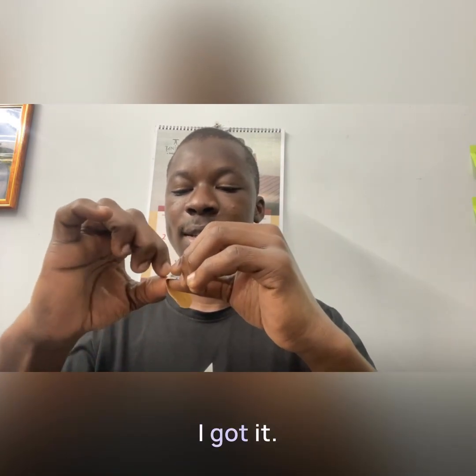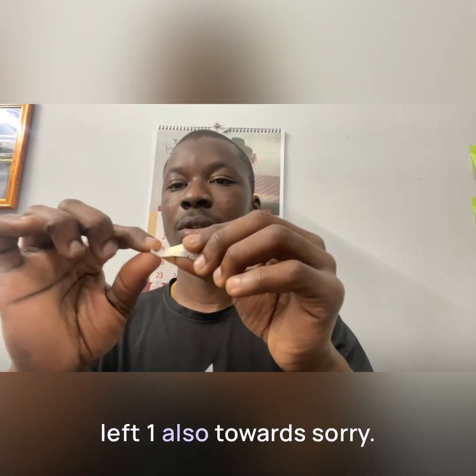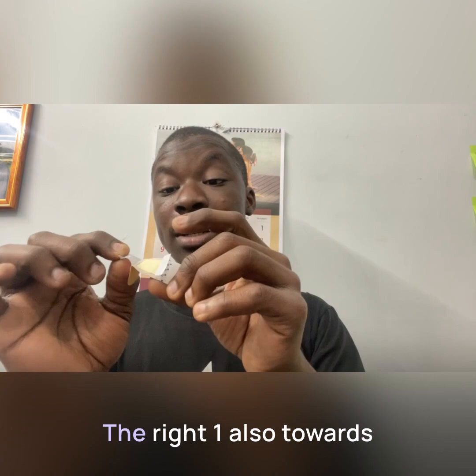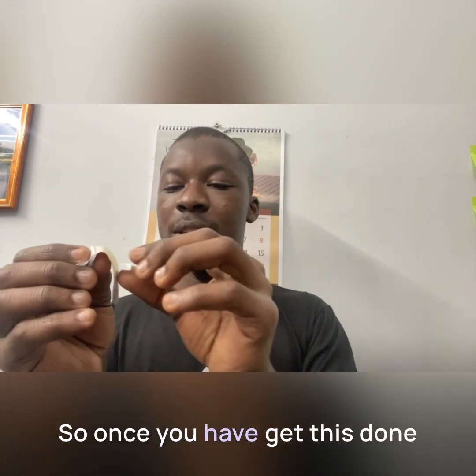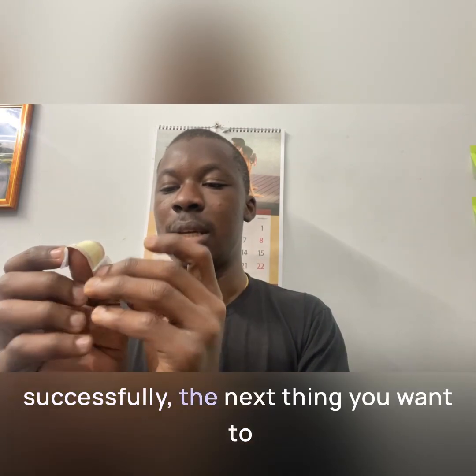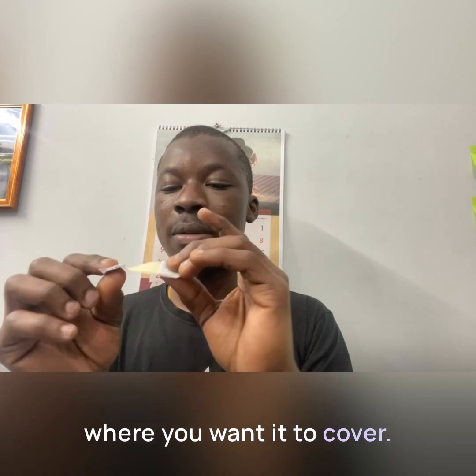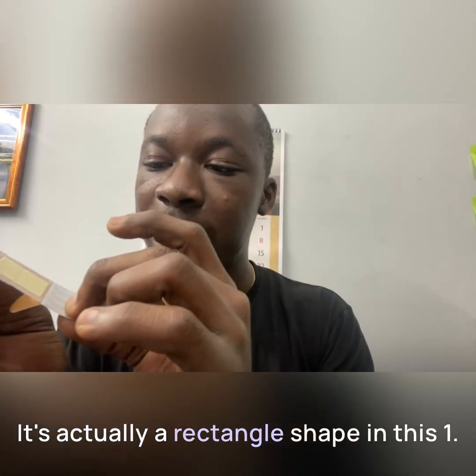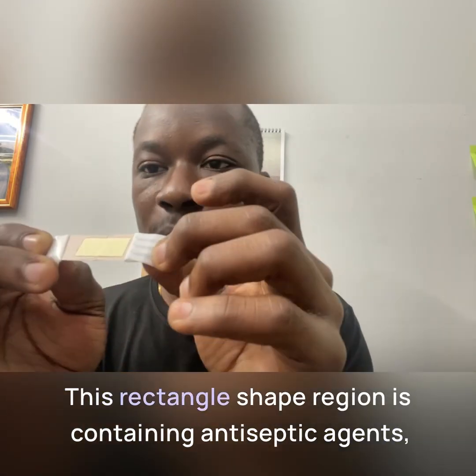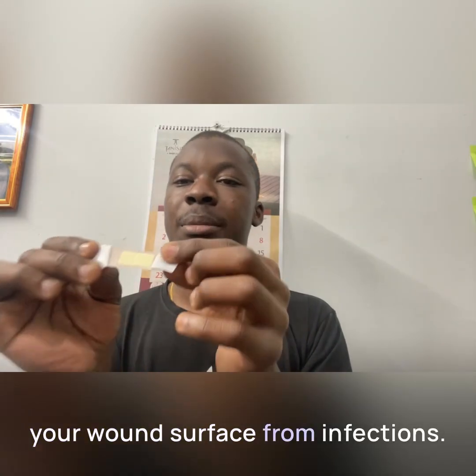Yeah, I got it. So I'm moving the right one also towards the right-hand side. Once you have done this successfully, the next thing is to apply it on the surface you want to cover. As you can see, this region here is a rectangle shape. This rectangle-shaped region contains antiseptic agents which prevent your wound surface from infections.